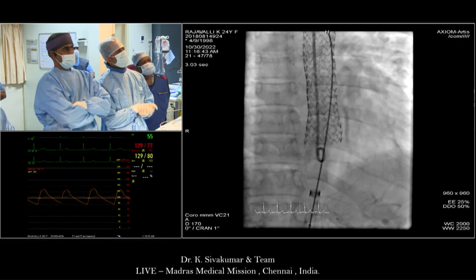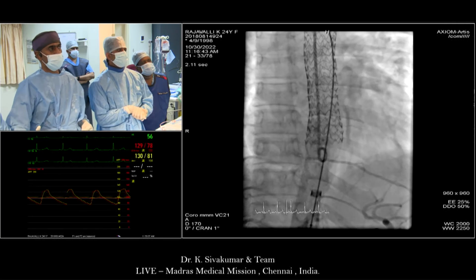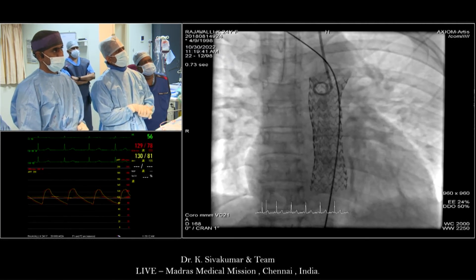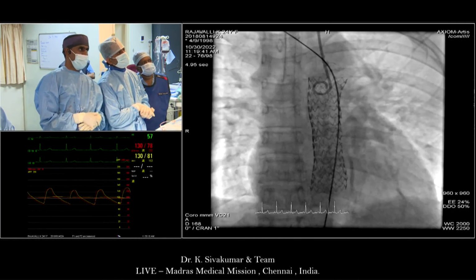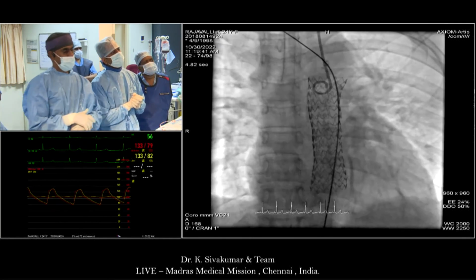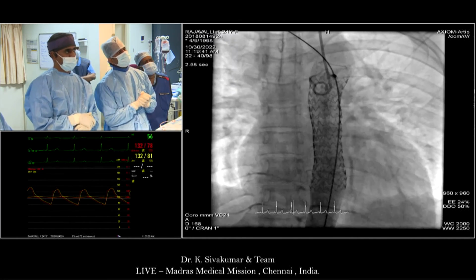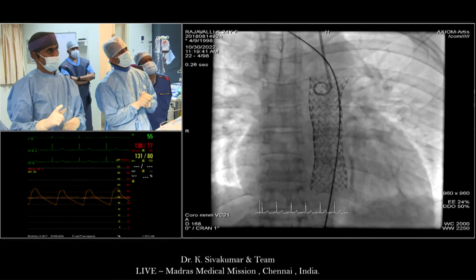So the distal end of the thoracic aortic covered stent, we flared it with a 20 millimeter Tyshak balloon. Next. The proximal end also to 20. We sealed the aneurysm. Contrary to our original impression that we were planning to use 2 stents, since this 79 millimeter long covered stent is a non-foreshortening stent, it remains at 79, and so it is able to cover and entirely seal it off with a single stent.